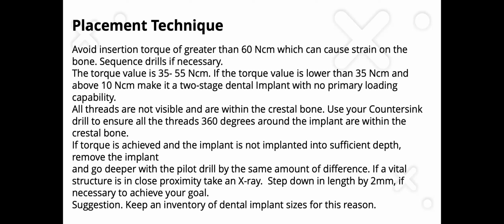If you achieve your torque but you feel like you've already bottomed out, remove your implant, reestablish your pilot depth a little longer with your osteotomy former, and reinsert your implant.